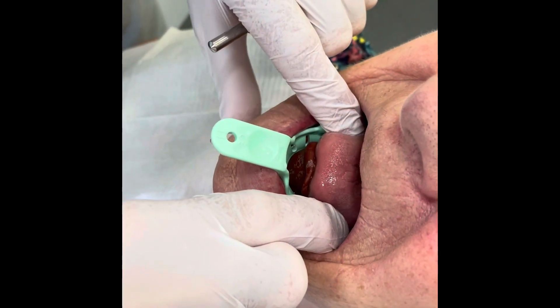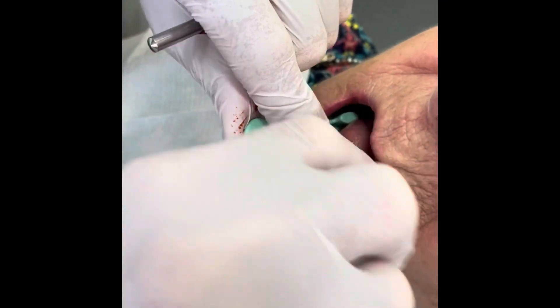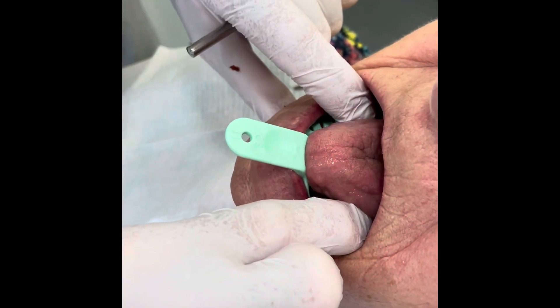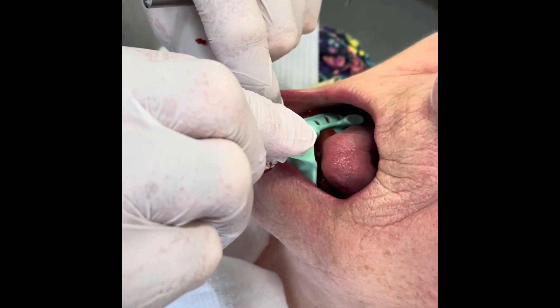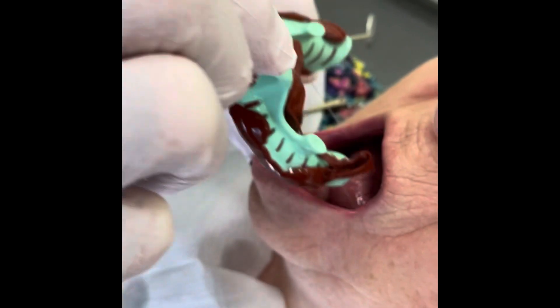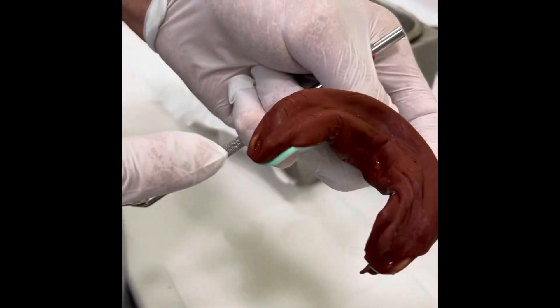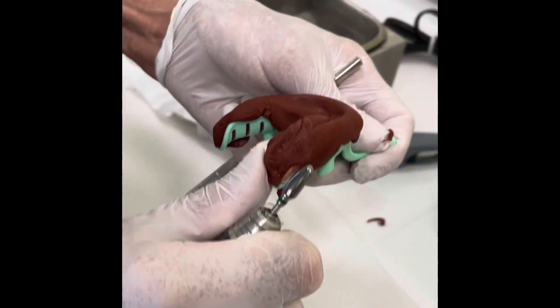Fingers on the top, thumbs under the chin. Hold it down with one hand, stick your tongue forward — can you lick your top lip left to right? I'm going to take that out. Okay, the tray is poking through, causing a bit of discomfort on both sides, so I'm just going to go with a coarse burr to trim off some of the tray before we do the second part of the impression.